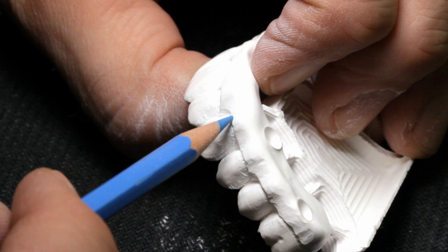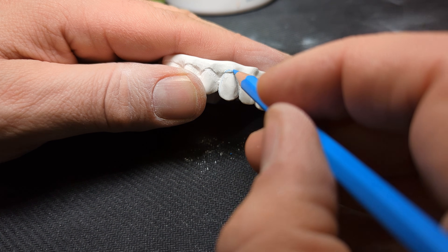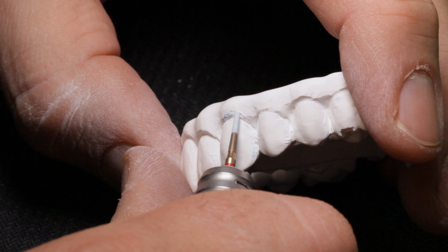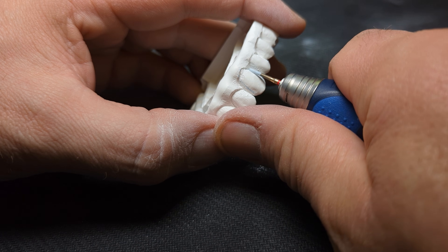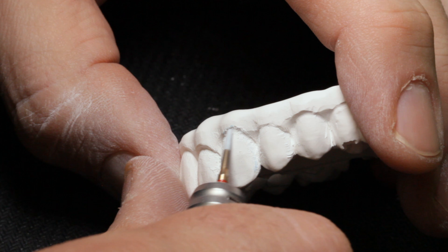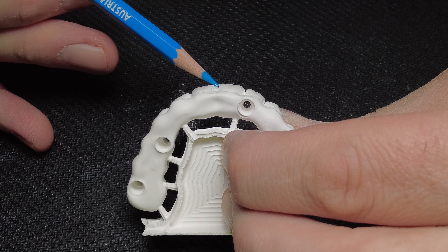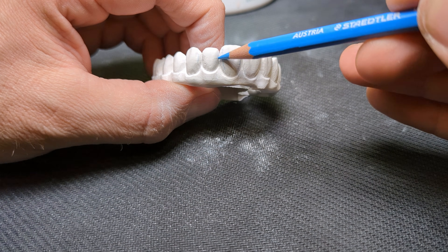Things like changing the height of the zenith are impossible and dangerous to do in sintered zirconia. Ideally, you would design those correctly, but since I am not a great designer, I have to fix these things afterward. I like to draw on zirconia in ceramic to visualize the areas I need to adjust. That way, I can carve out the interproximal transitional line angles and give the teeth more character and definition.